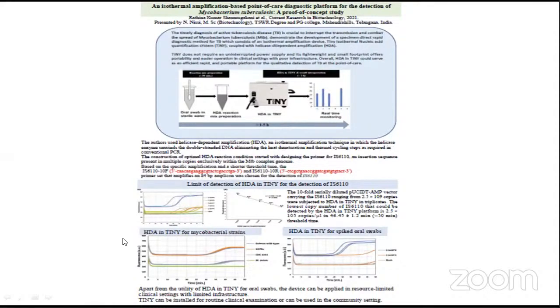Diagnosis of tuberculosis is essential to initiate treatment and implement infection control measures. However, not all TB cases are successfully identified. Sputum microscopy is the most commonly used diagnostic method for tuberculosis in TB laboratories.